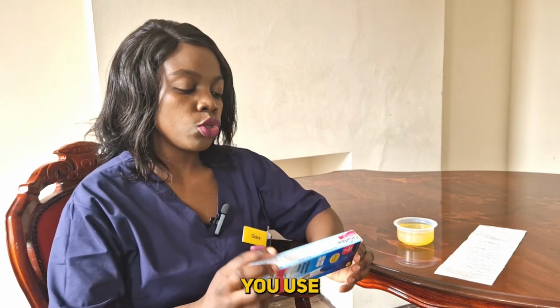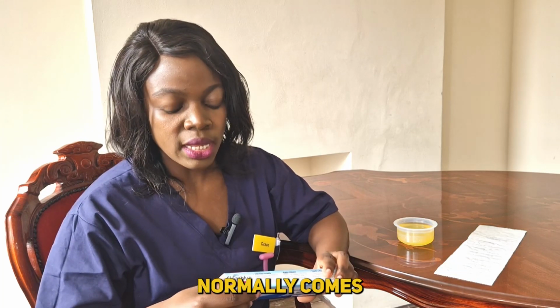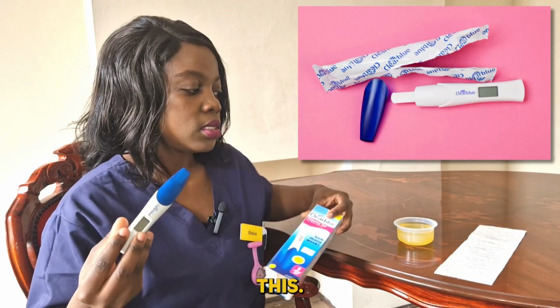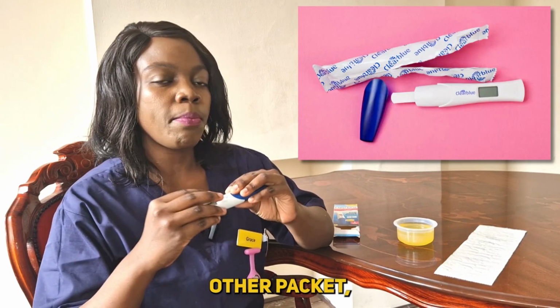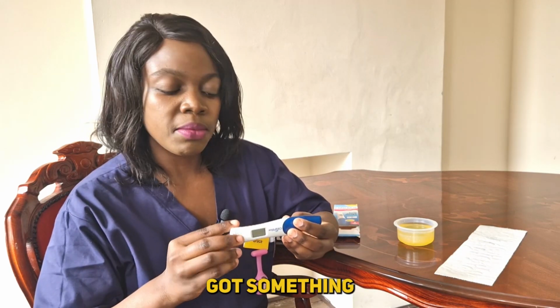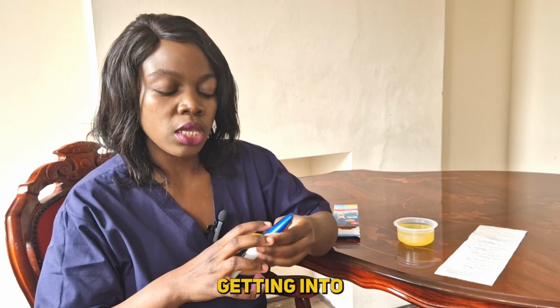And before you use your strip, this was in a box, but even if it's in a box, it normally comes in another sachet inside. So you can see this one, I already removed the sachet. It doesn't come like this. It comes in another packet, and the other packet has got something that prevents moisture from getting into the strip.